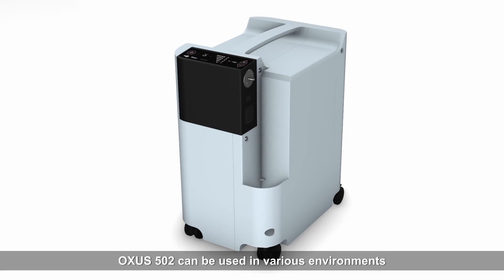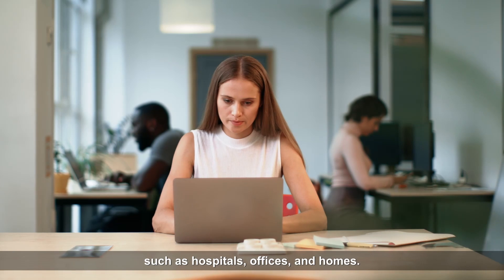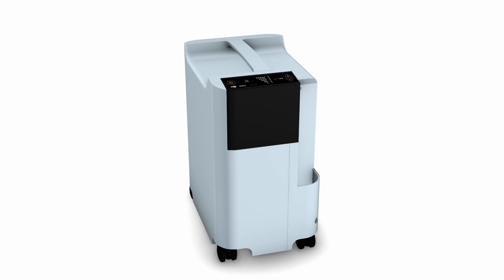Oxys 502 can be used in various environments, such as hospitals, offices, and homes.